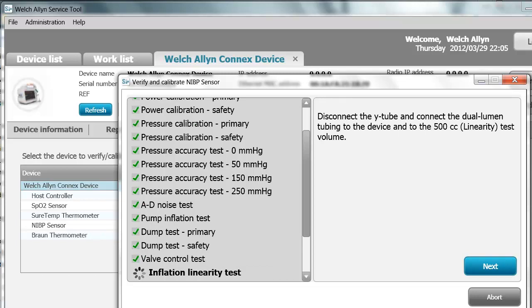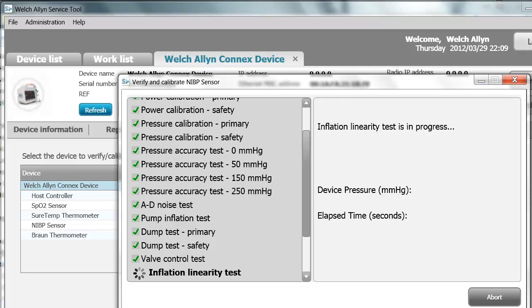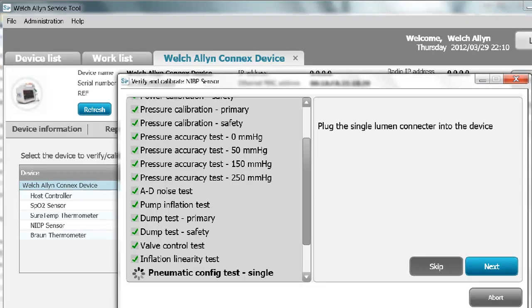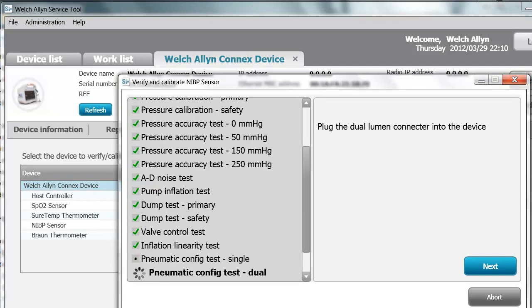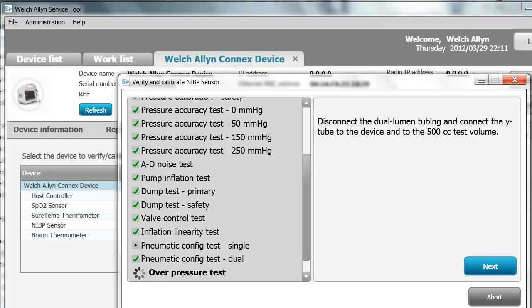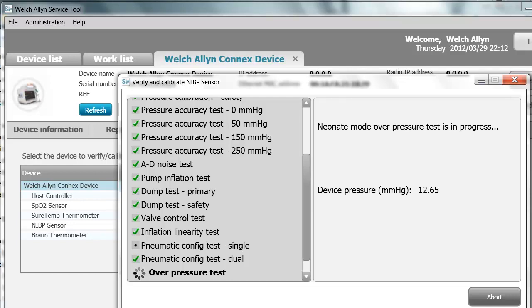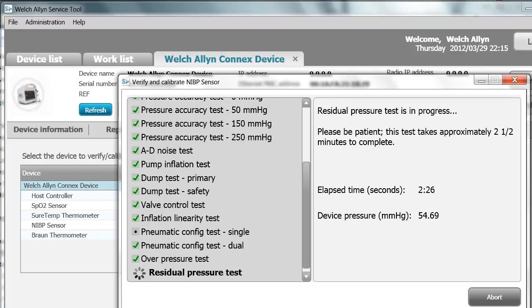Disconnect the Y-tube and connect the dual lumen tubing to the 500 cc test volume. With fast BP technology, the blood pressure is taken on the way up — one tube measures the noise level while the other listens for the pulse. Next, test the single lumen connector, as this device can take both single and dual lumen tubing. Next is the overpressure test. It uses the 500 cc test volume and will go through both adult and neonate mode. The residual pressure test takes two and a half minutes to complete.